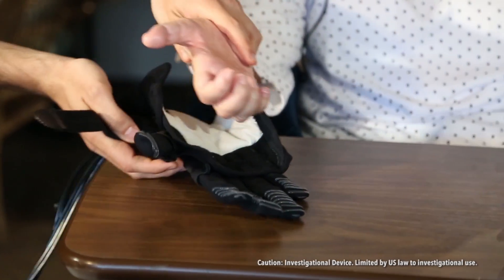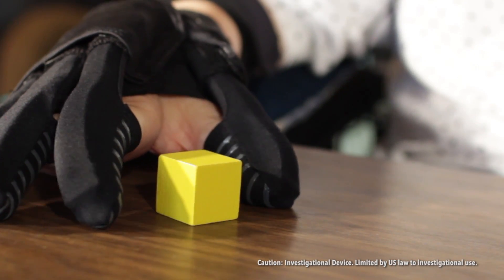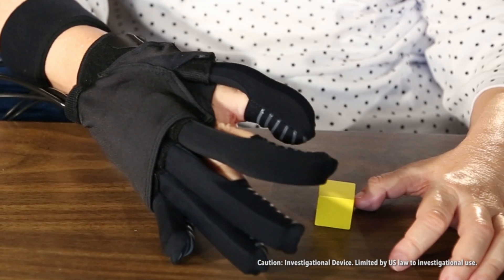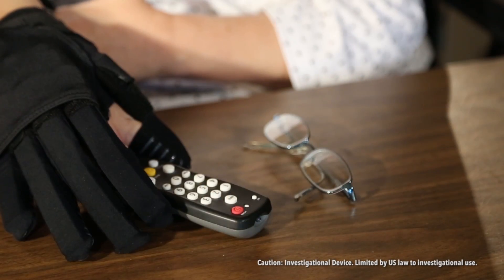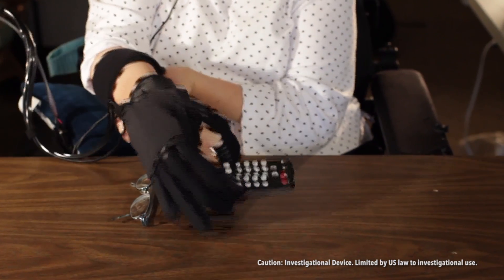When we have a patient that we see, we're trying to understand what is the size of their hand and what are the motions that they're trying to perform. And then when we build the soft robotic actuators, we can actually mechanically program them by tailoring the material properties so that those actuators produce the desired motion that is also similar to what the motion of the fingers would be if a person was healthy.